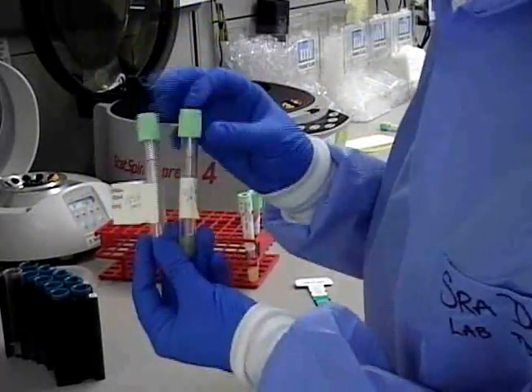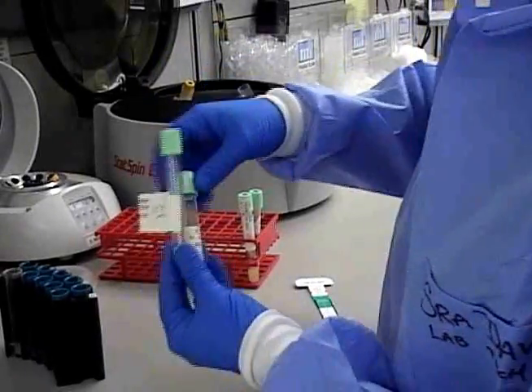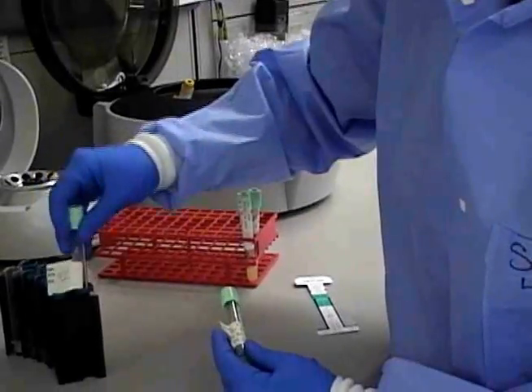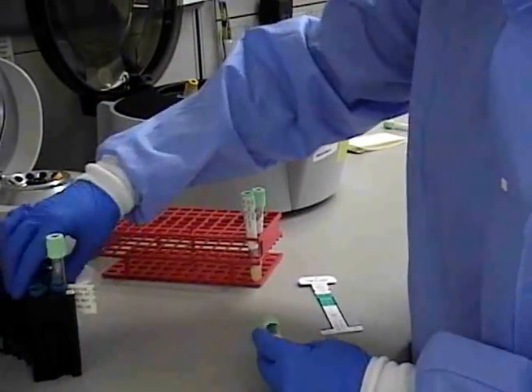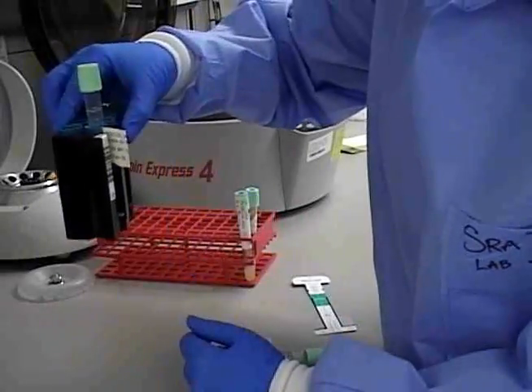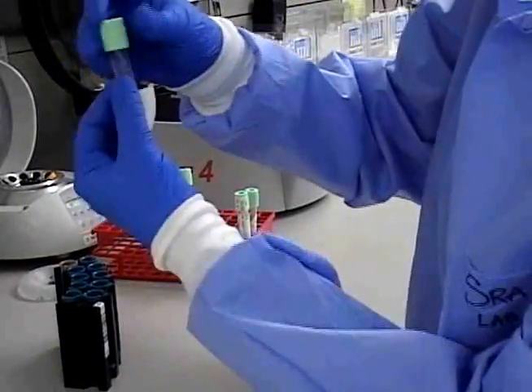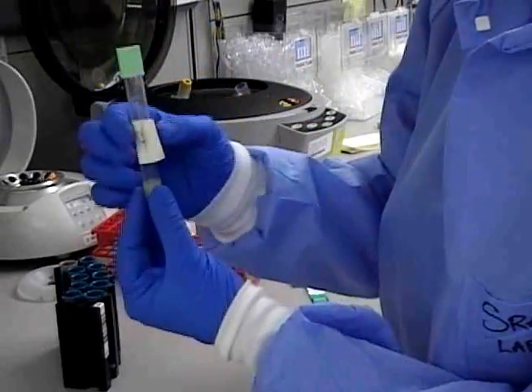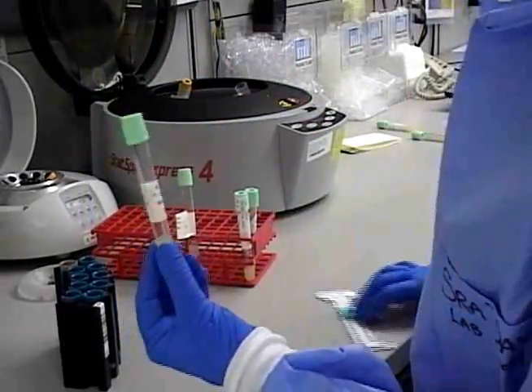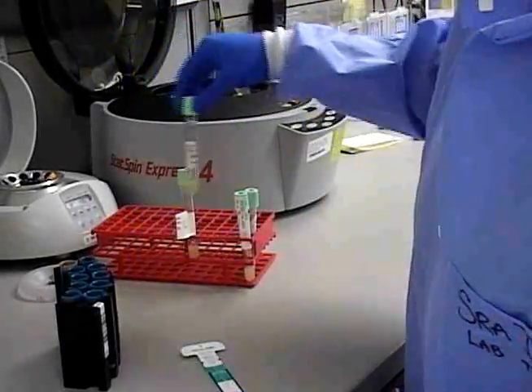These, with the little tails, give us problems because they don't fit in our racks. Also, they don't fit in our specimen racks, and if it's like this, it hangs off here and will catch on the machine when trying to analyze it. Also, if it's like this, we cannot see how full the tube is because it is completely covering the proper fill line. These can both cause a delay in testing.